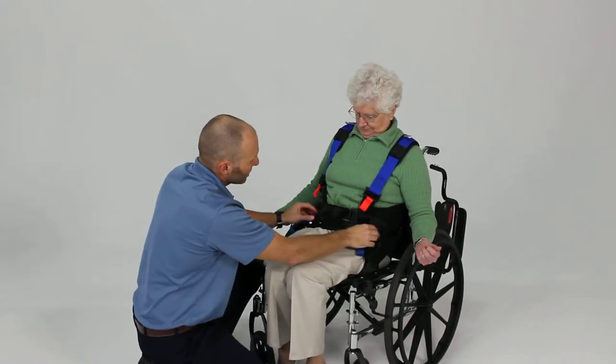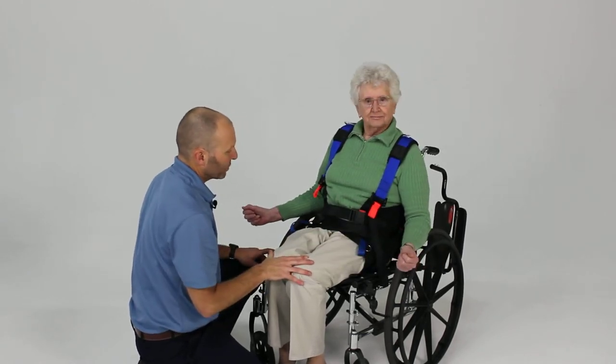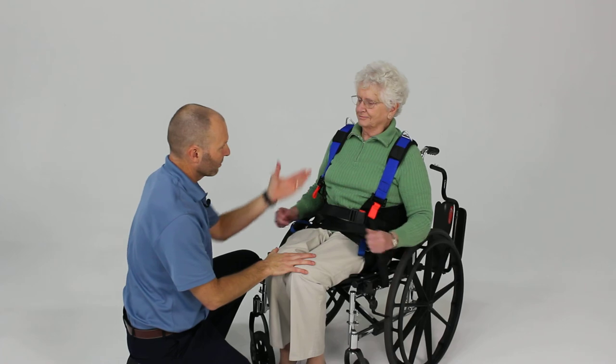We can take a little more slack at the waist, and now we've got it in position to bring the patient to a standing position by attaching to our overhead support system once we're ready to stand.